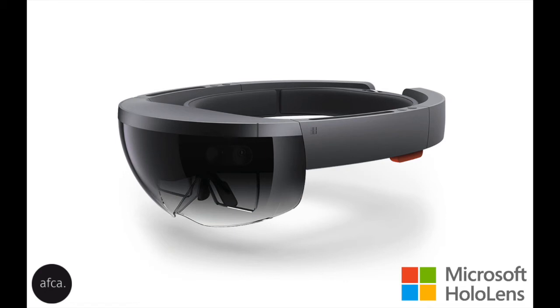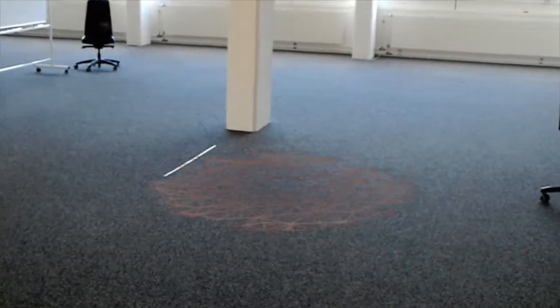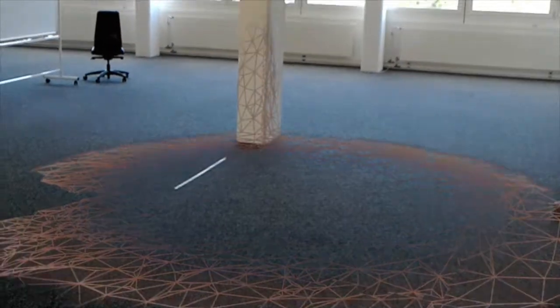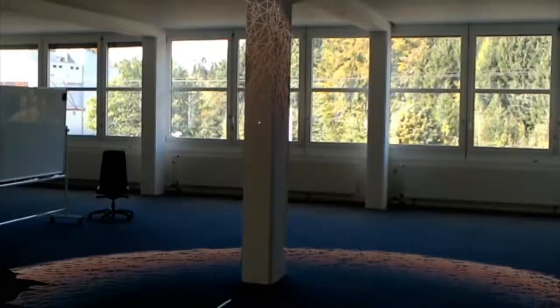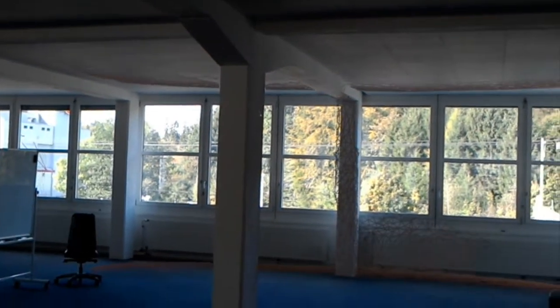The Microsoft HoloLens is a wearable computer that scans its surroundings continuously with several sensors and is able to project holograms in the room.